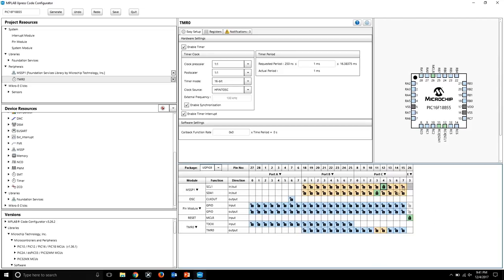At this point, what I usually like to do is generate the code. If you're on a shared network or on Wi-Fi especially, I usually like to do it so that even if there is a disconnection from the Wi-Fi or your computer has some issues, it at least saves up to that point.